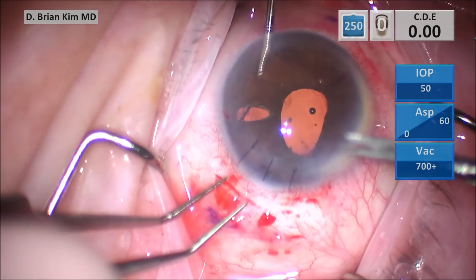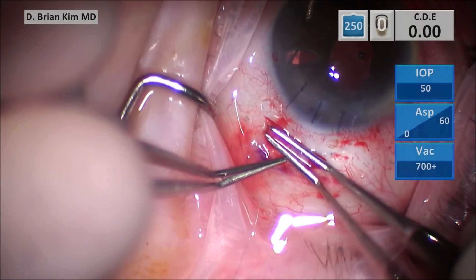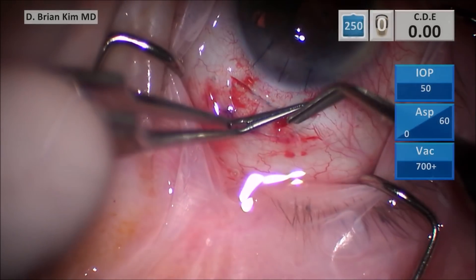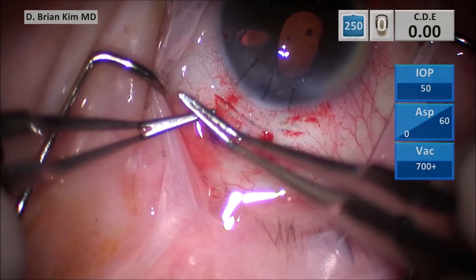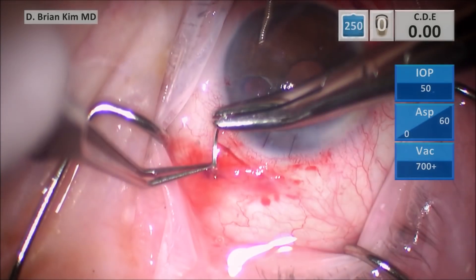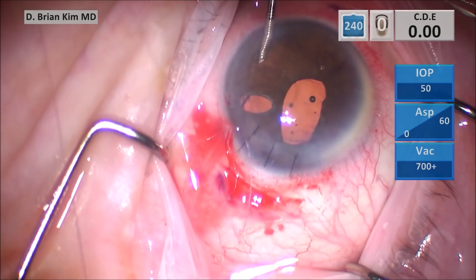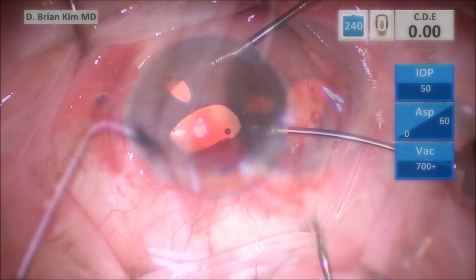After you do that, you want to trim the tips. If you can, try to bury the knots as much as possible into the groove — it's a little bit of a challenge, but that's what the groove is there for. The groove helps protect the polypropylene suture from degrading. One thing I would have done differently: when I externalized the suture through the scleral groove, I would have given myself a lot more suture to work with. Because I had smaller loops, it was more of a challenge to make those throws. Make sure you have a long enough suture with each pass so that when you cut them, you'll have a lot more suture to work with.